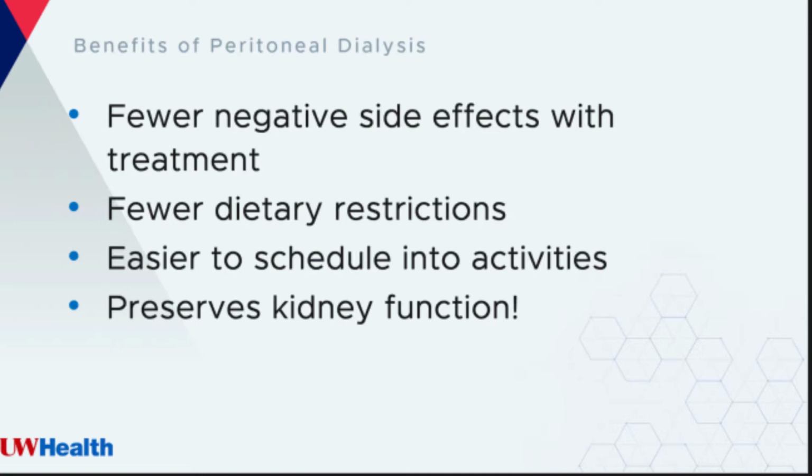Hemodialysis in-center is very time restrictive. Patients must attend at least 3 times per week, and it often interferes with patients maintaining jobs and activities of daily living. Travel must be prearranged, and peritoneal dialysis is set up as a home therapy that's intended to be run by patients, and it makes it much easier for them to pack their supplies and go on trips. One of the best advantages to using peritoneal dialysis is that it helps preserve what kidney function the patients still have left. So if they're still making some urine, it will allow that kidney to still do that.